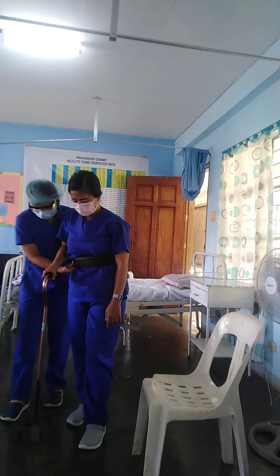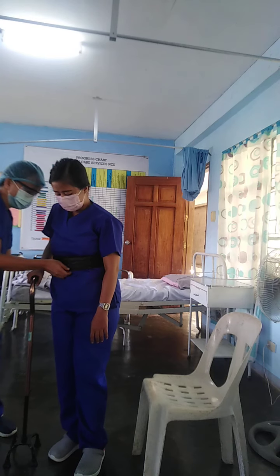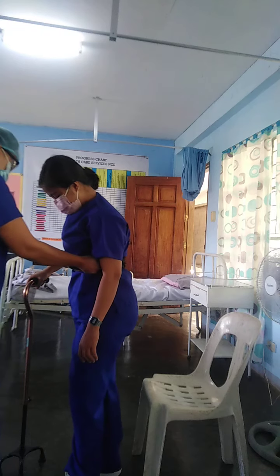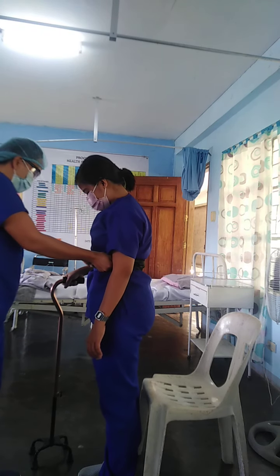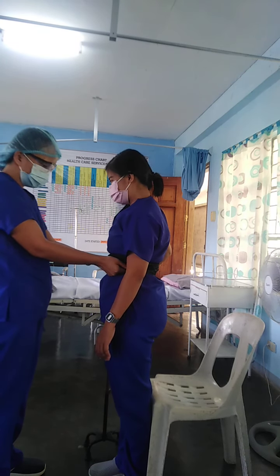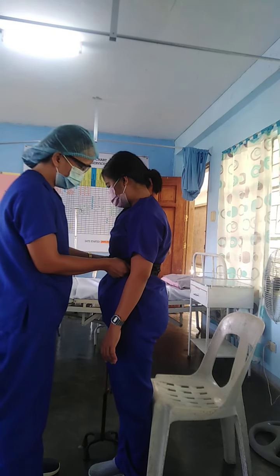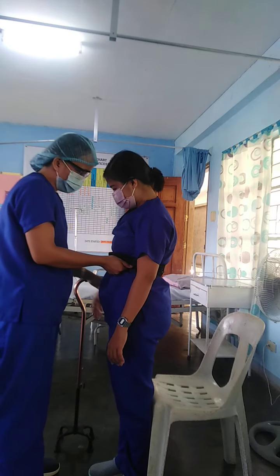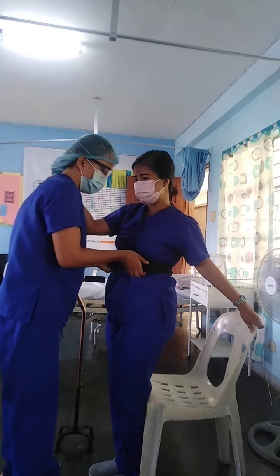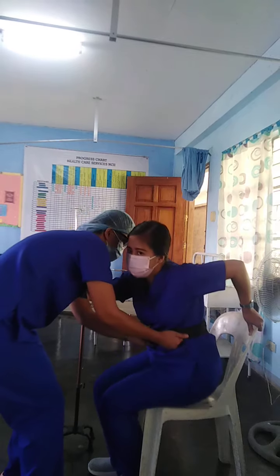Weaker leg. And then, ilipat po tayo, ma'am. Sige po, ma'am. Patalikod po. Walapit sa upuan. Weaker leg. So, ulipat din. At the count of three, ma'am — upo ka po. One, two, three. Down. Okay, ma'am. Very good.